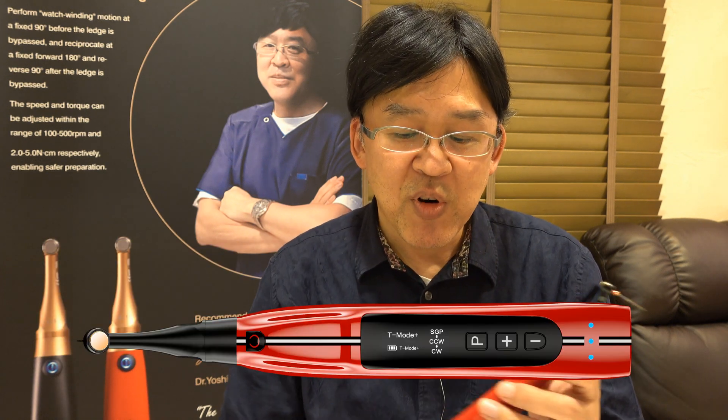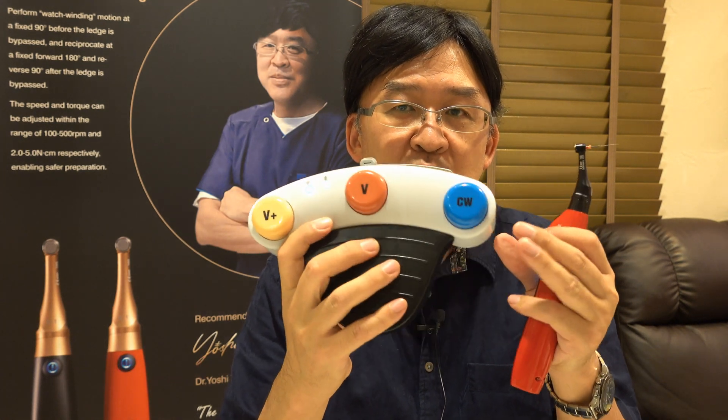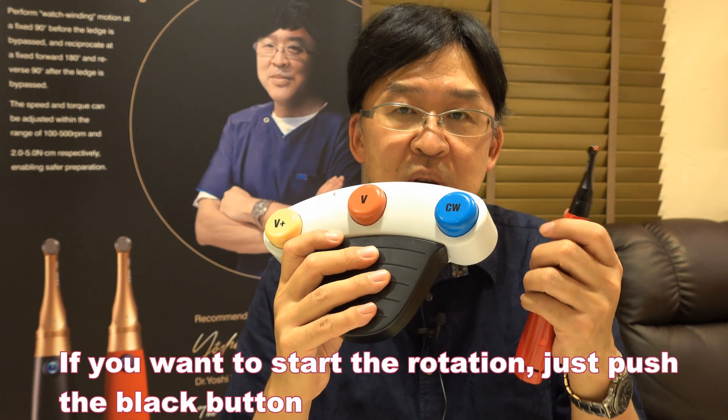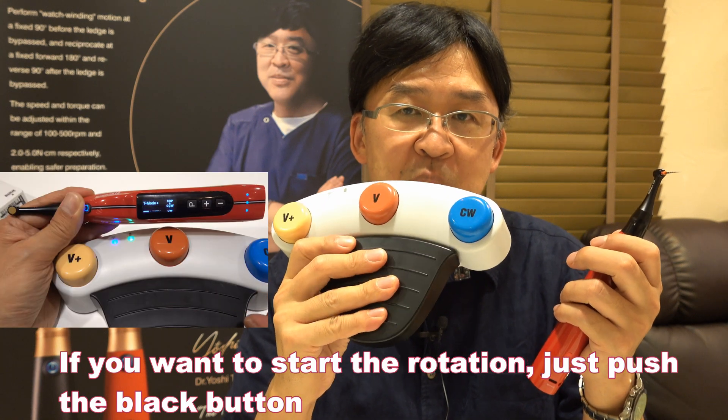First of all, this motor is controlled by the foot control. There are 4 buttons: black, yellow, red, and blue. If you simply want to start the rotation, just push the black button.